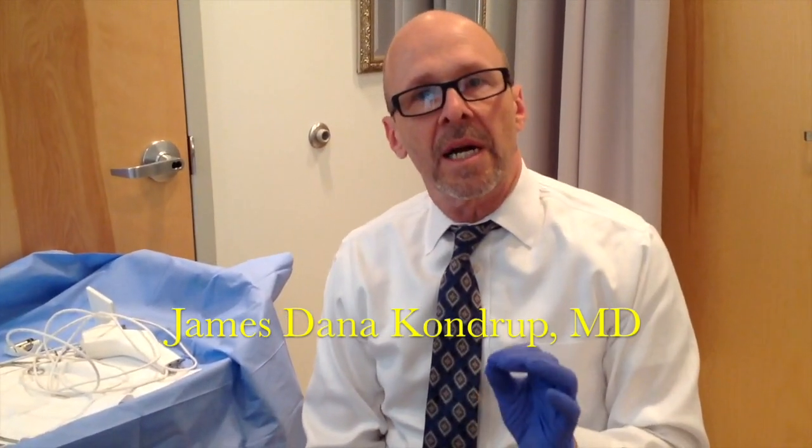Today we're going to be using the new Lina Operascope to take out an IUD. This is just a brief picture of the setup — this isn't actually sterile, but I'll show you what we do.